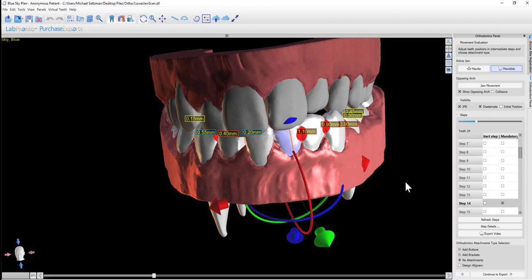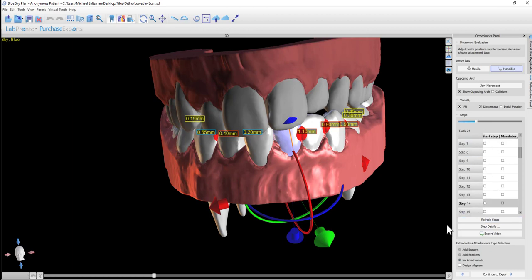So once you've made your modifications, you need to click the refresh steps button, because if you force the tooth to be in a position at a particular step, or you forced it to start moving, or to continue moving at particular steps, then the software will recalculate the number of steps, and it will update the list that we have.